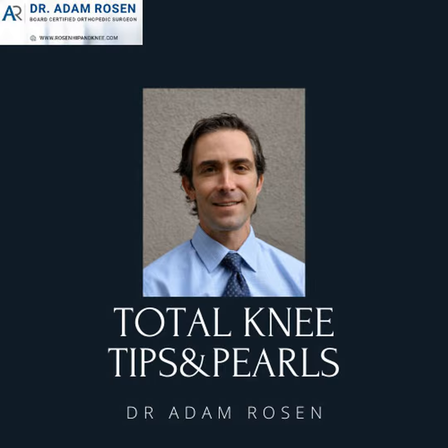But again, I'll work up superiorly, get the anterior flange, anterior chamfer, distal lateral condyle, distal posterior chamfer laterally, and again, that really posterior cut. This is the more difficult one to get. And at this point, you've hopefully opened the whole thing up. Then, if you've done a really good job and it's really loose, you may start to see it knock off.